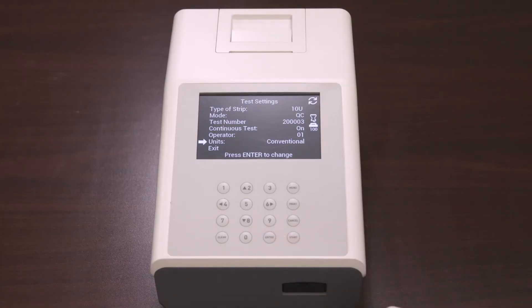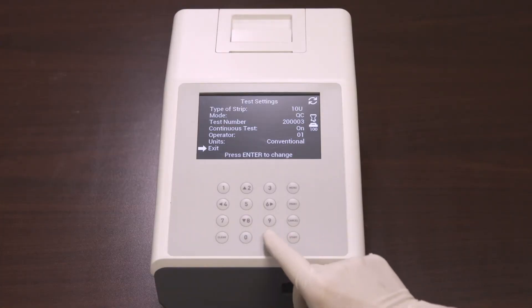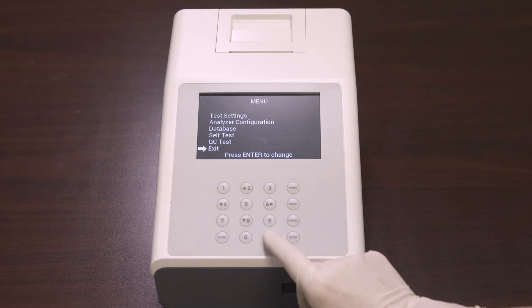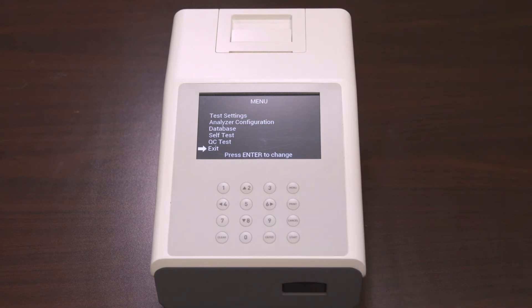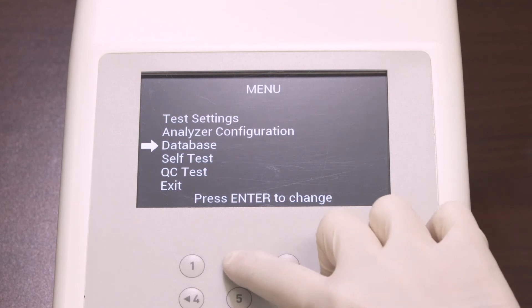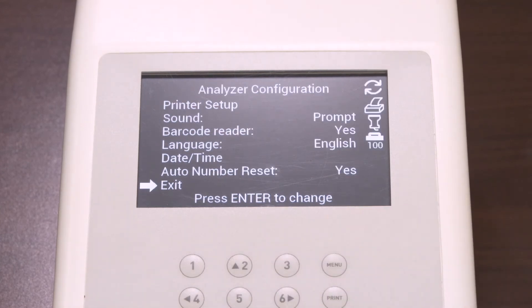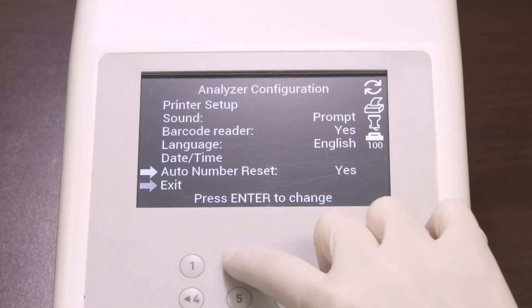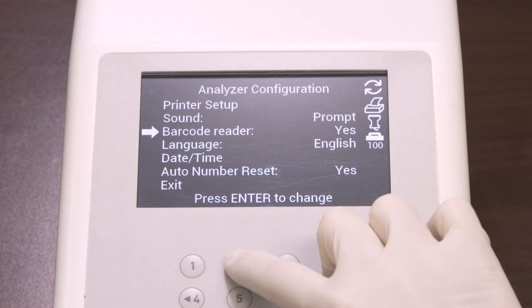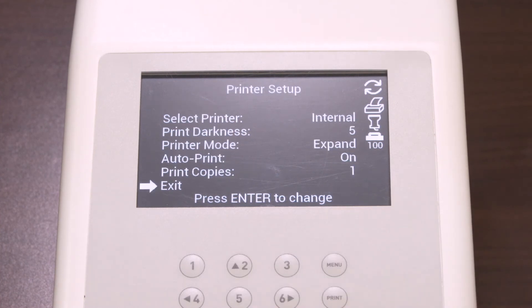Once you finish all your selections for the test settings, select exit and press enter to return to the main menu. You can configure your analyzer by selecting analyzer configuration and pressing enter. Select the printer setup to navigate through the printer properties.